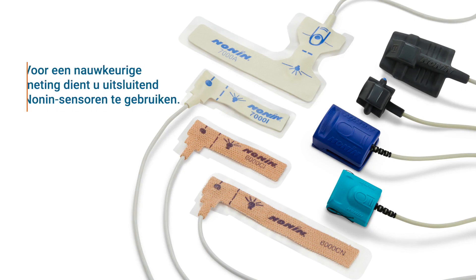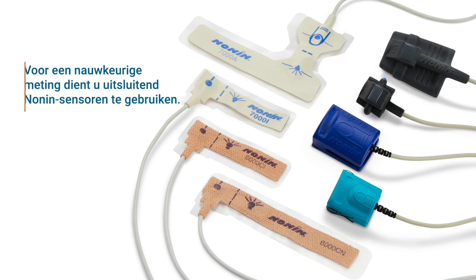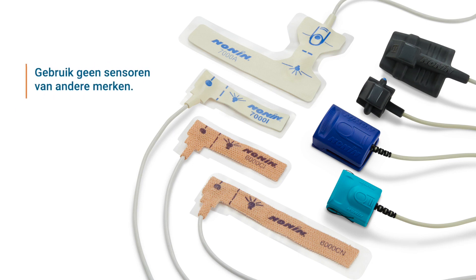The Nonin Model 7500 pulse oximeter measures oxygen saturation and pulse rate and is compatible with the full line of pure light sensors from Nonin Medical. To ensure an accurate reading, Nonin brand sensors must be used with the pulse oximeter.